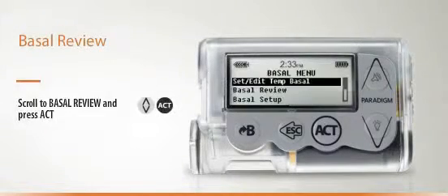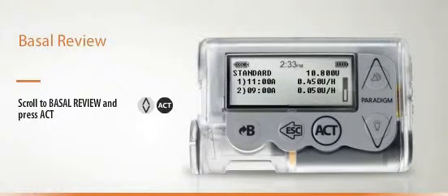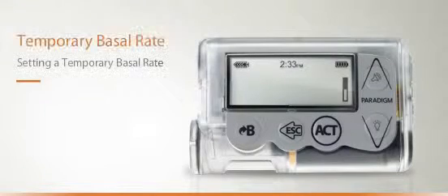To review your basal rates and times, scroll to Basal Review, then press Act. Use the up and down arrows to view all basal rates you have set. You may find during the day, due to changes in exercise, activity, or illness, that you need a temporary basal rate.